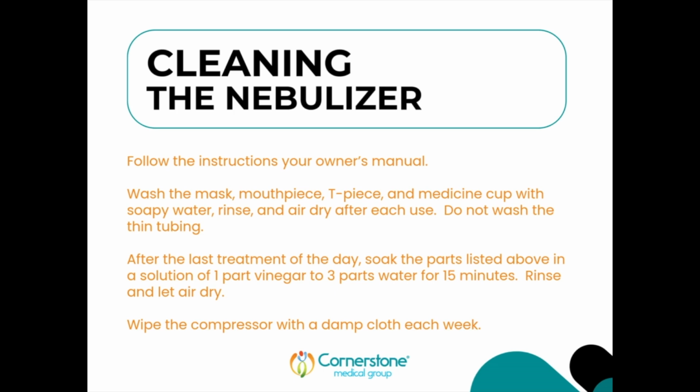Cleaning the nebulizer. Follow the instructions in your owner's manual. Wash the mask or the mouthpiece, the T-piece, and medicine cup with soapy water, rinse and air dry after each use. Do not wash the thin, long tubing. After the last treatment of the day, soak the parts listed above in a solution of 1 part vinegar to 3 parts water for 15 minutes. Rinse and let air dry. Wipe the compressor with a damp cloth each week.